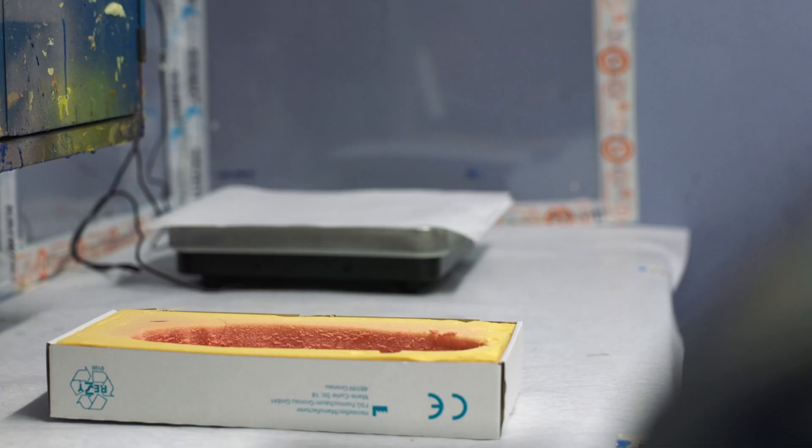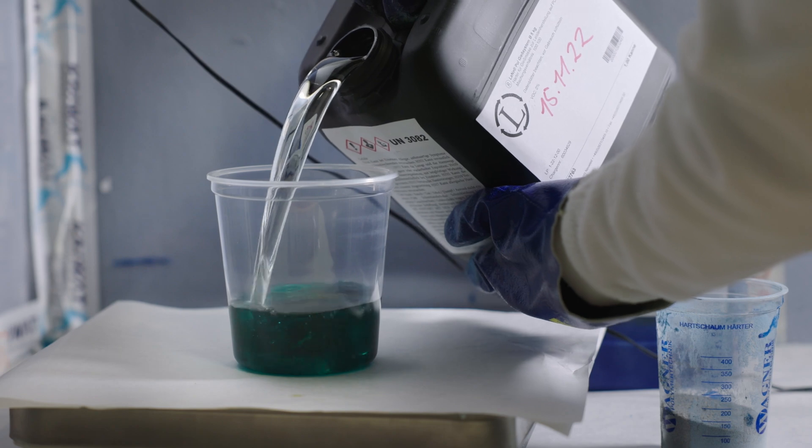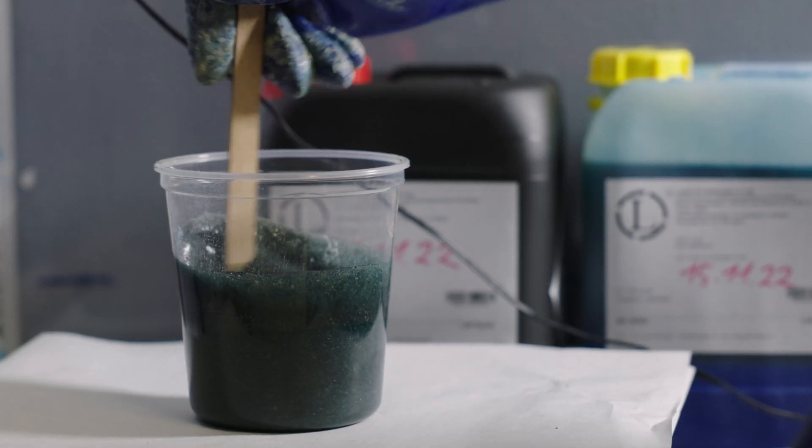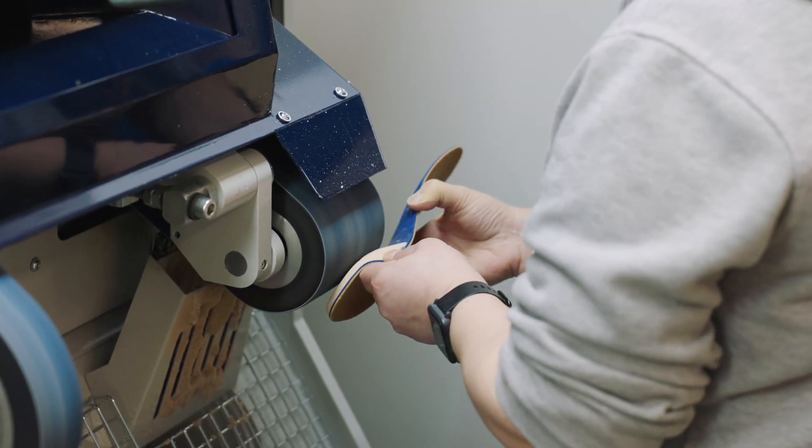The traditional workflow for insole production often involved a lot of chemicals. In order to create a custom insole, we created a so-called foam mold, which was then filled with chemicals. A lot of things need to be sanded on a grinding machine, which meant a high exposure to chemicals and lots of dust. This is the reason why I committed to doing things differently, so that we can appeal to the workforce as an employer.